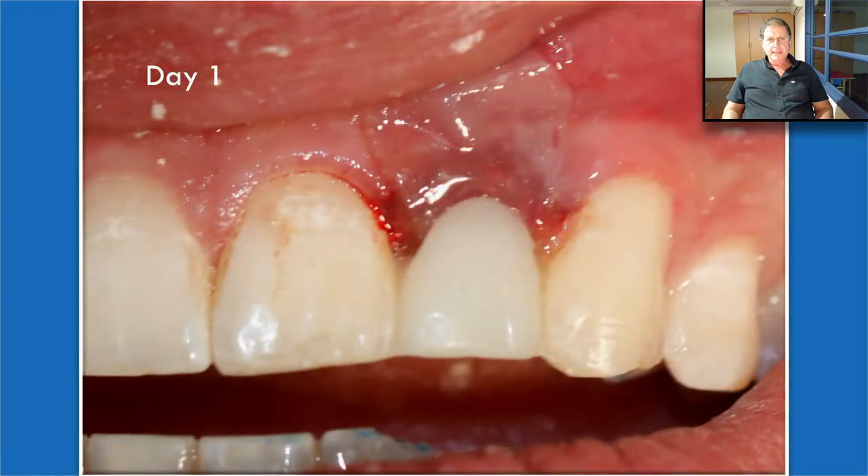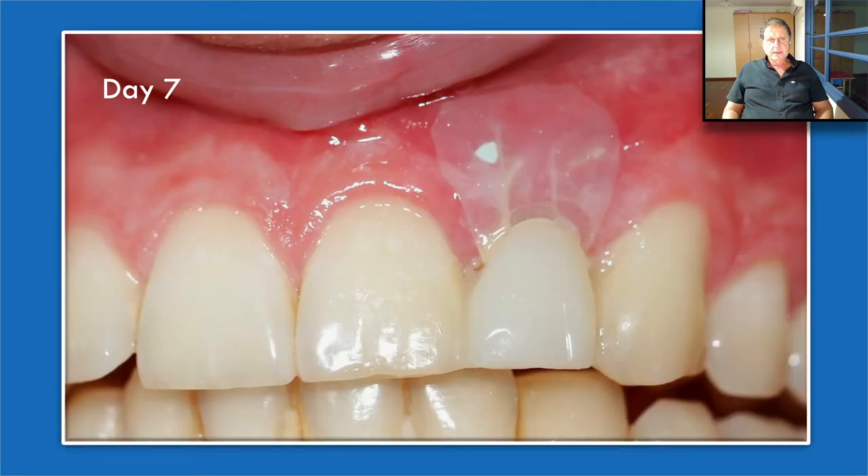Let's see what happened. That is day one. After seven days, we can see the resorption of the Oraid, but it's still in place. I want you to look at the color of the soft tissue when it comes in contact with the Oraid — it's perfectly pink. There is absolutely no inflammatory reaction or any sensitization between the Oraid and the soft tissue. That's just amazing.